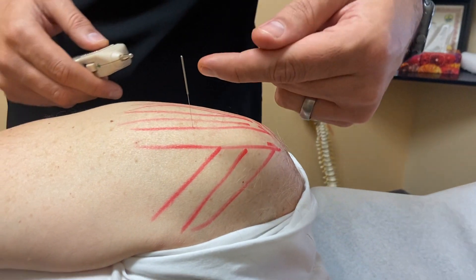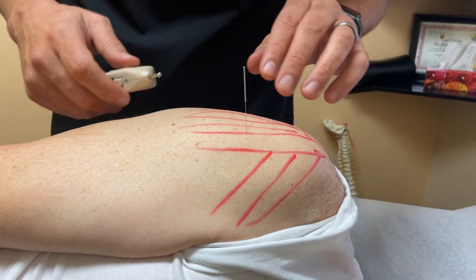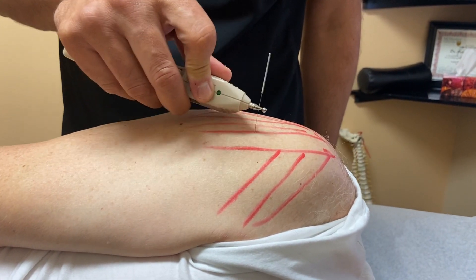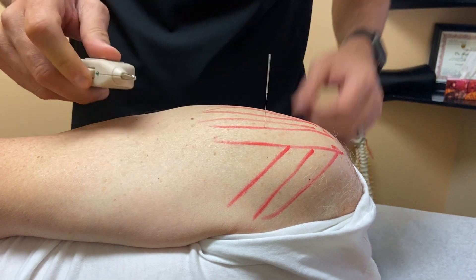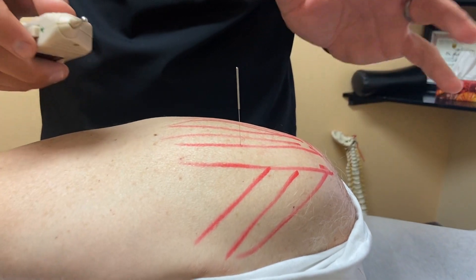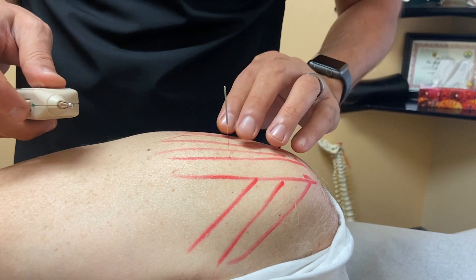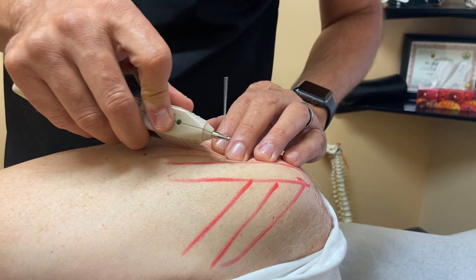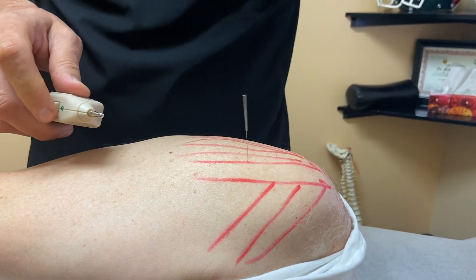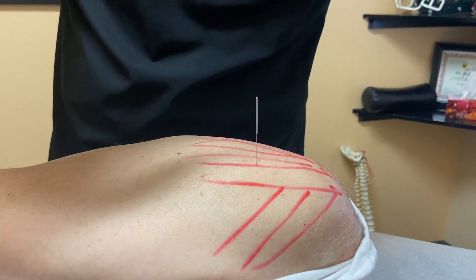When we stimulate the needle, we can see the needle inside the muscle. If I stimulate it by itself nothing happens, but I need to use my non-dominant hand to ground the actual unit. If I put my hand on the patient and compress, we can see a little bit of movement, but we need to compress the tissue to direct the electrons into the muscle.